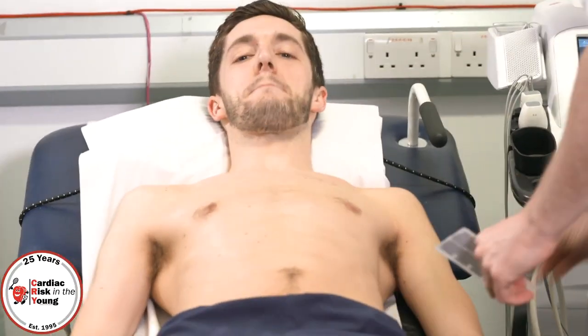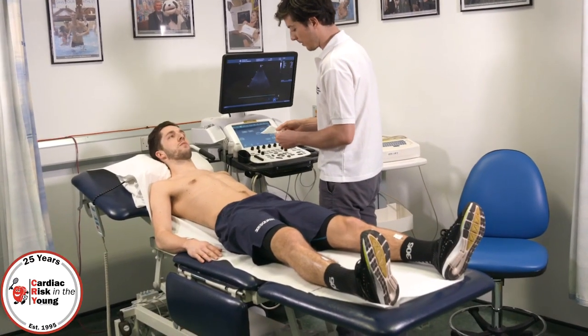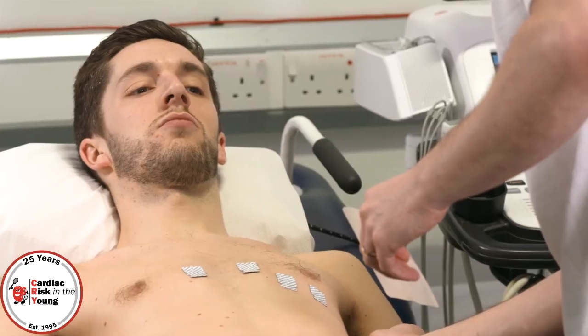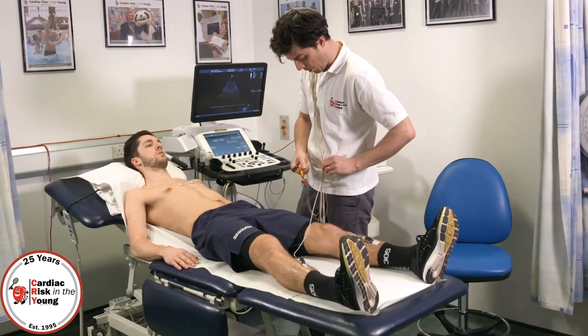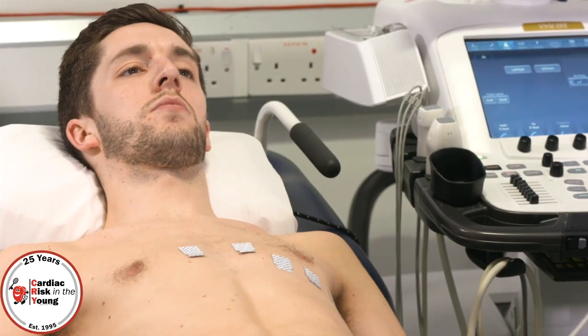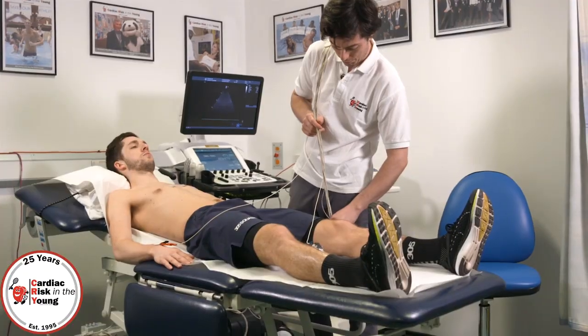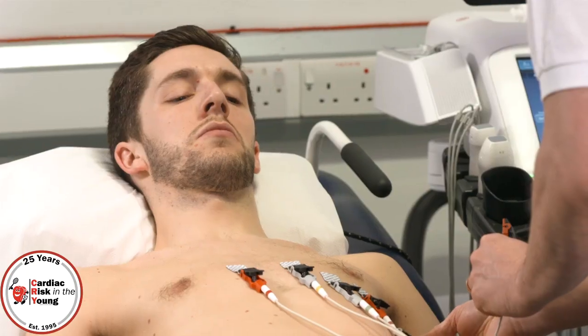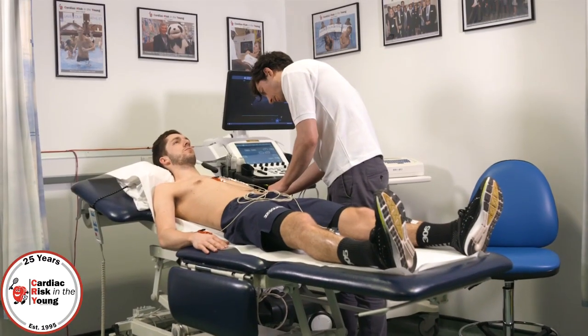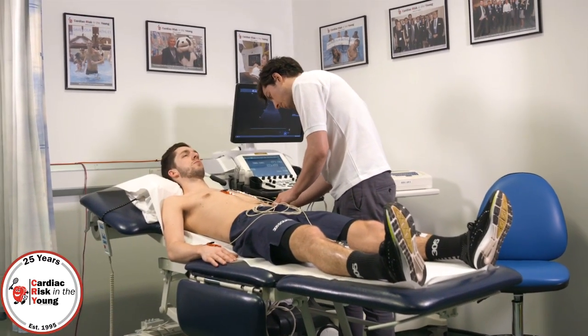I just got to stick these ten stickers on. So it's an electrical tracing of the heart to get your heart rhythm and heart rate. This test only takes about five minutes max. Everybody who has a cardiac screening will undergo this test. But the ECG is a very powerful test — it gives us a lot of information and it's very quick. Basically all you need to do is lay nice and still and just relax. This picks up muscle tension and muscle movement as well.